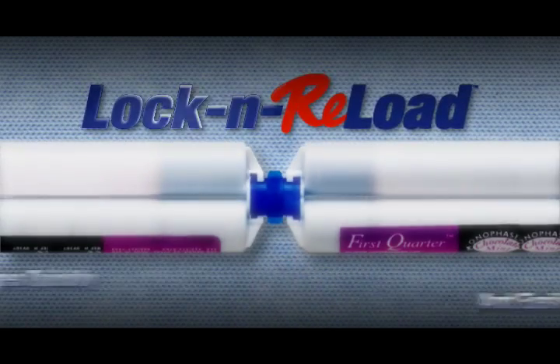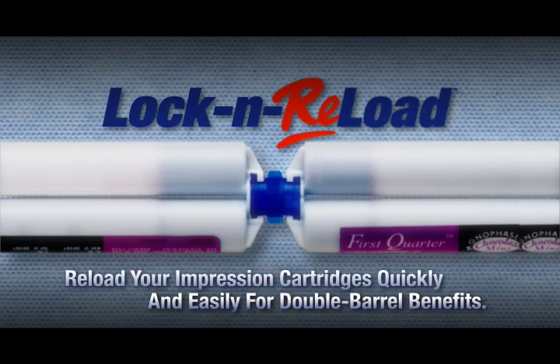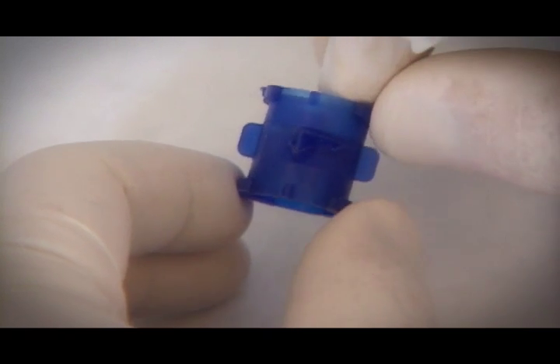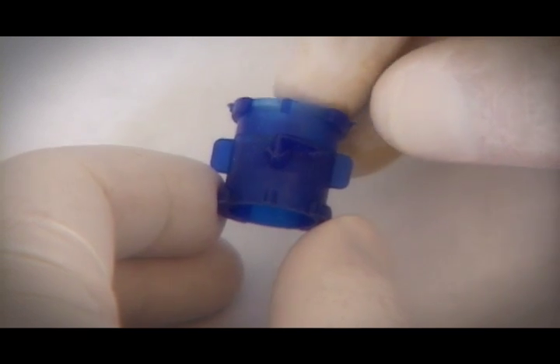The Lock and Reload Coupler is the solution. Quickly and easily make full tubes out of used ones. The foolproof design lets you reload dozens of tubes and makes it impossible to mix the catalyst and base. The Lock and Reload Coupler has a unique design which prevents accidental mixing of the impression material while backfilling.